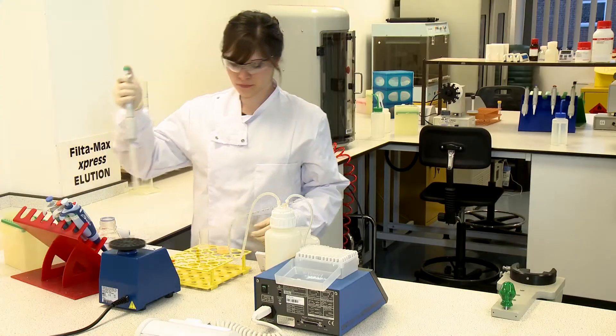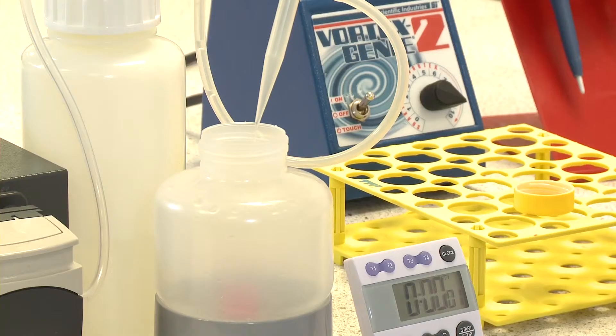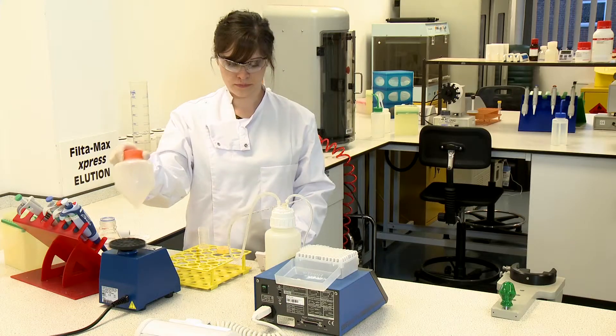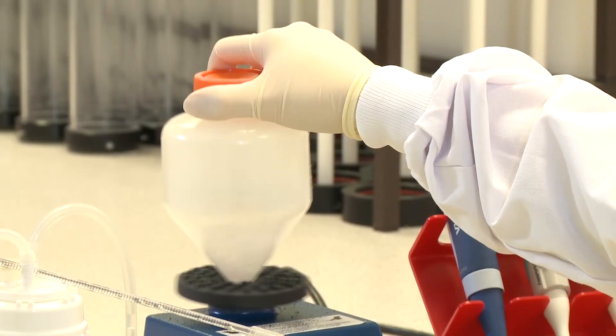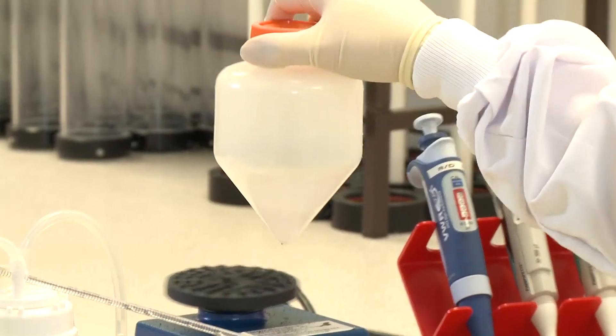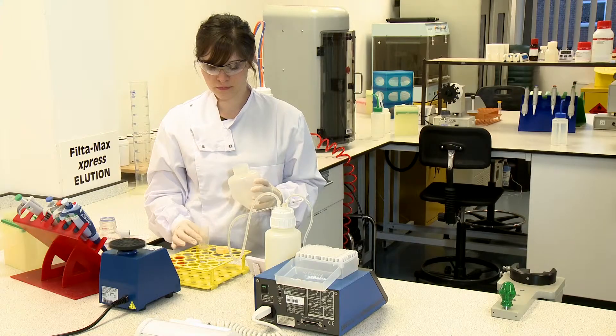Add the first rinse of 10 millilitres of reagent water into the 500 milliliter sample tube and vortex at full speed for 20 seconds. Shake the sample and pour into the 50 milliliter sample tube.